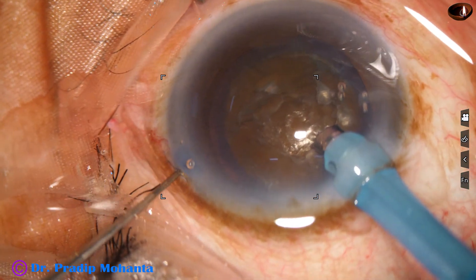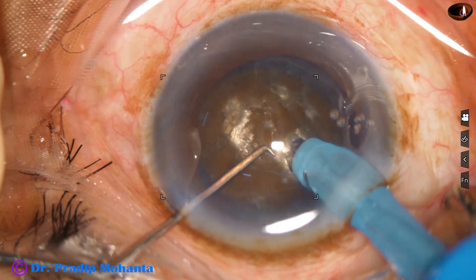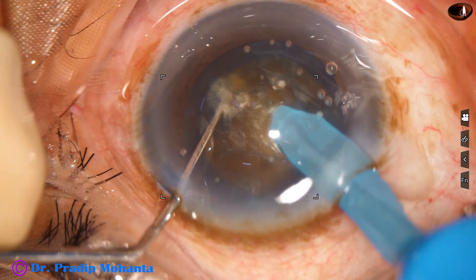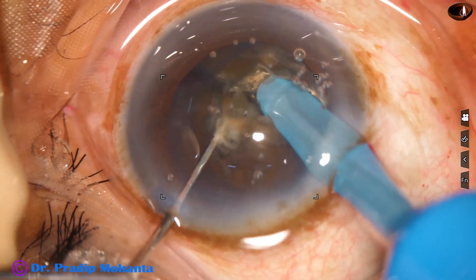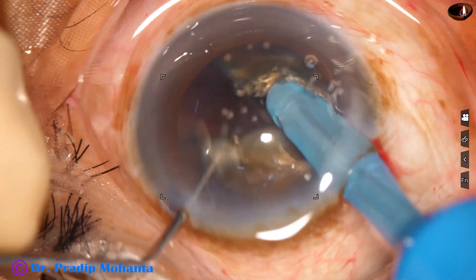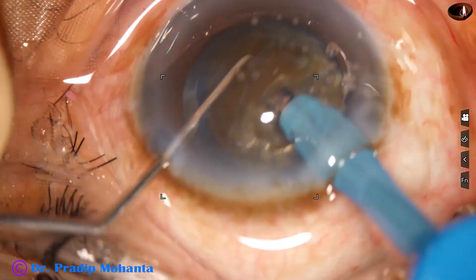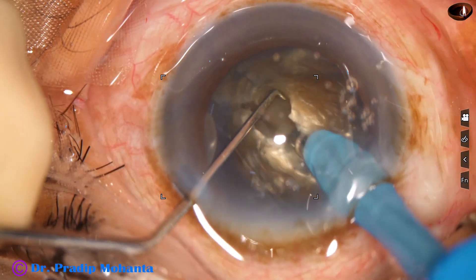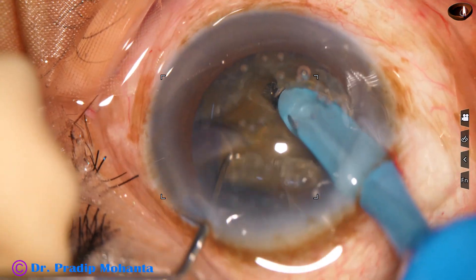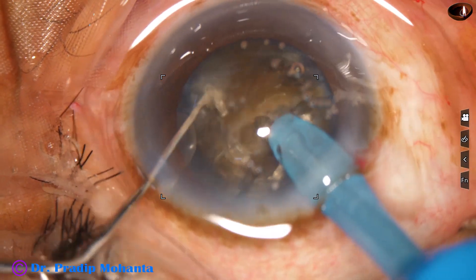Now watch submarine chop. The nucleus is pushed a little down, the tip is buried into the substance of the nucleus, and it goes through towards the opposite equator. As it reaches near the opposite equator, a good crack is obtained. The nuclear mass is then rotated 180 degrees to come to the other side.